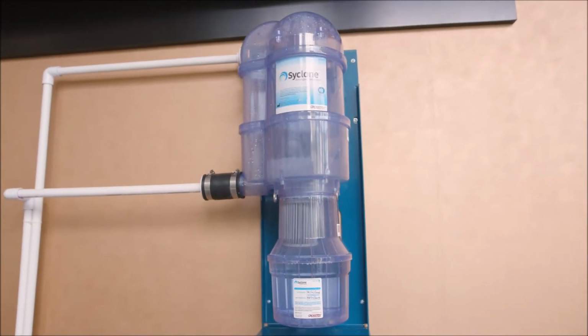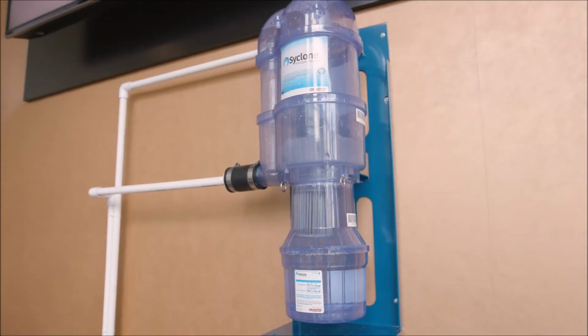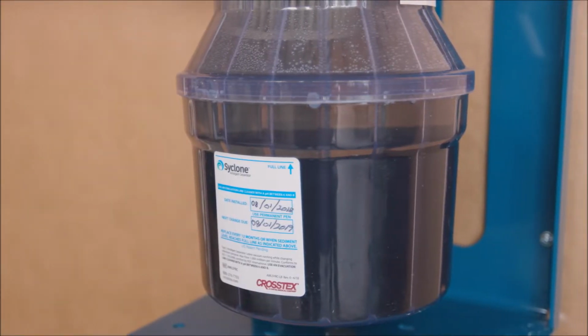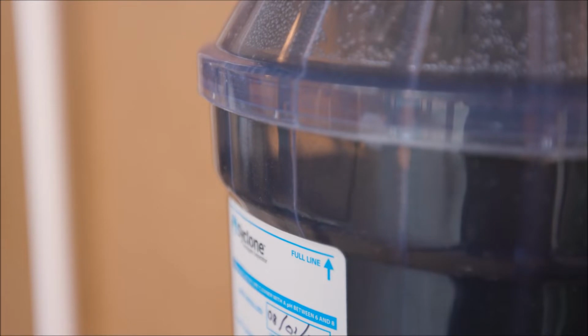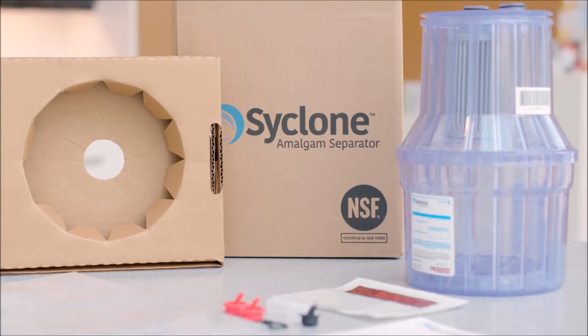To ensure proper function, weekly visual inspection of the Syclone amalgam separator canister is recommended. The inspection should include checking the level of the solids in the canister. When the sediment level reaches the fill line at the top of the label, or it has been 12 months since the canister was installed, it's time to replace the canister. A new Syclone canister can be ordered from your preferred dealer.